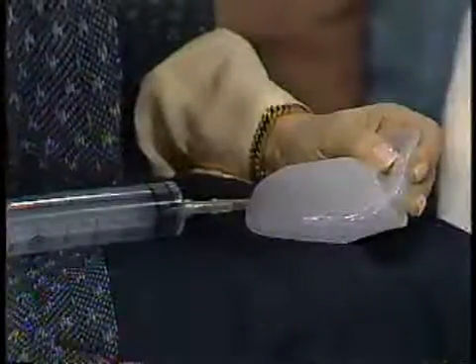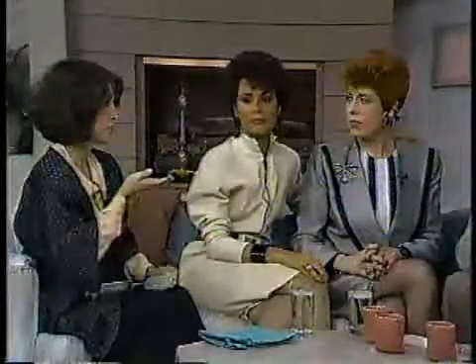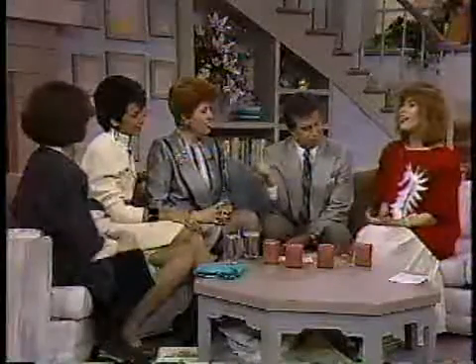I do not like going through the nipple areola because I don't like going through the breast tissue. And also for sensitivity, I would think. Right, there's a chance. I just don't like it, because if you get a scar that's hypersensitive around the nipple areola, it's very bad. I don't like scars under the breast because they may show. Unless, an armpit scar, nobody cares about. Nobody cares.